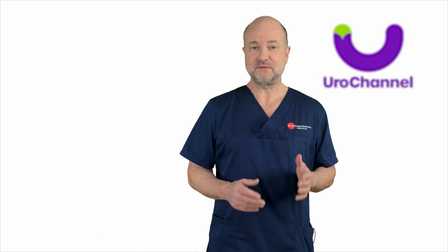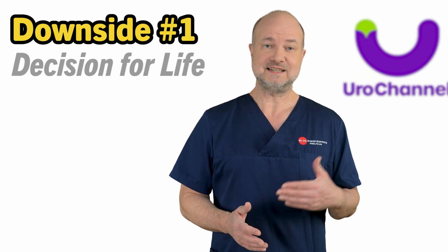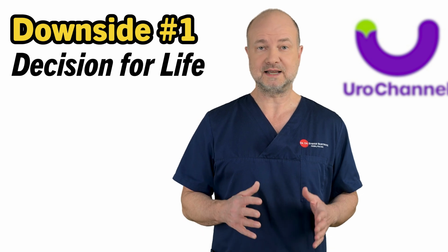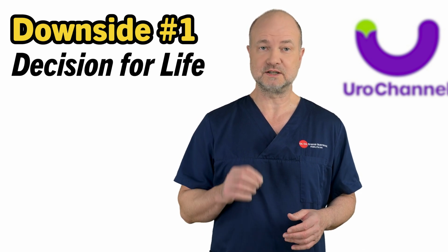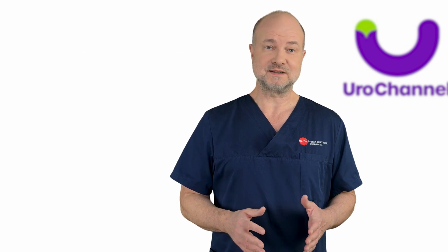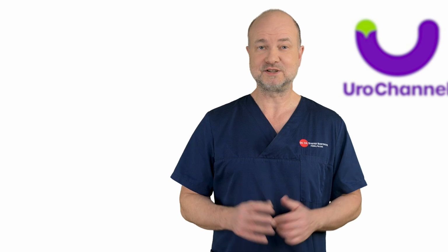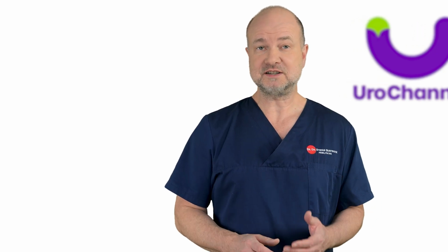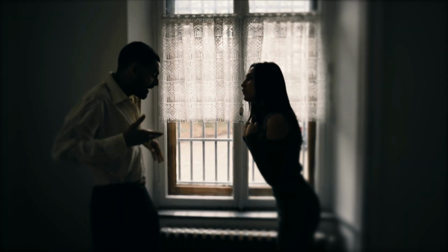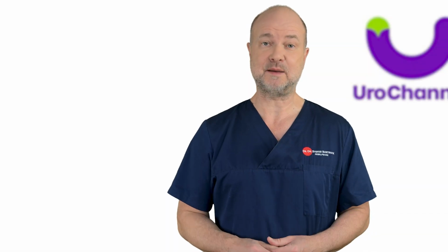But here are some things to consider. Downside number 1 is that it is a decision for life. Prosthesis placement will permanently damage the function of the original corpora cavernosa. Should you regret your decision once the prosthesis is in place, you can't make this damage undone. This is why shared decision-making within the couple is important. If the partner disagrees, you have a crisis on your hands. I didn't make that up, it has happened.